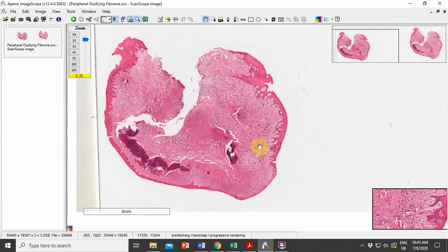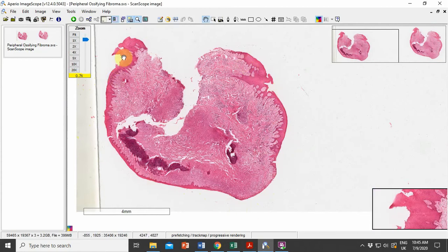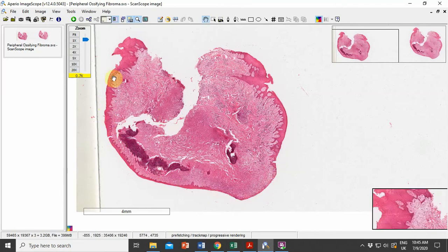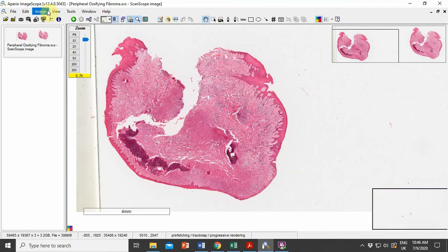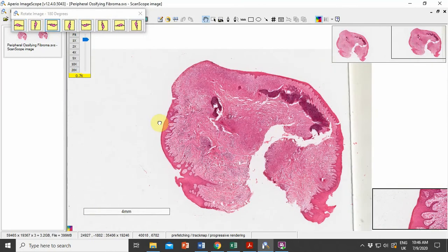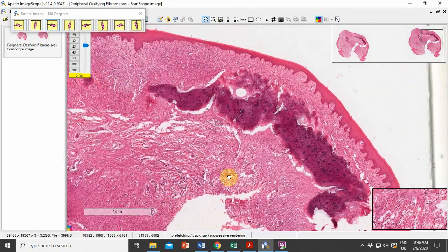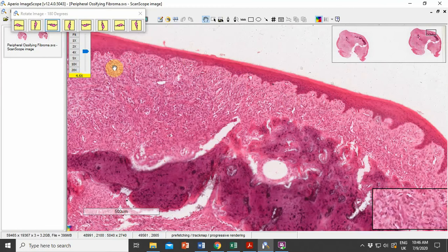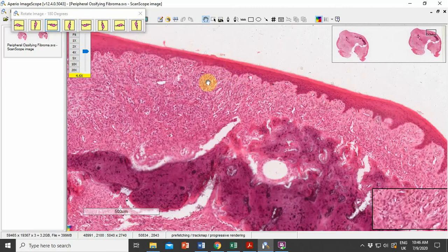At lower magnification, the tissue correlates to the excisional nature of the biopsy. As you can see, there is an epithelial lining on the periphery followed by the connective tissue. Upon magnification, we can notice that the tissue shows hyper ortho-keratinized stratified squamous epithelium with atrophic changes.